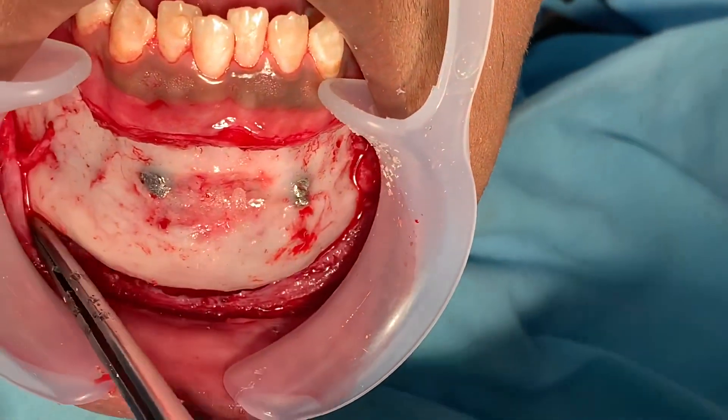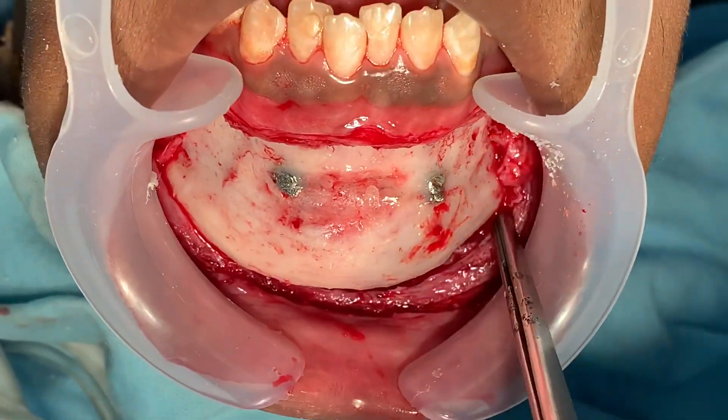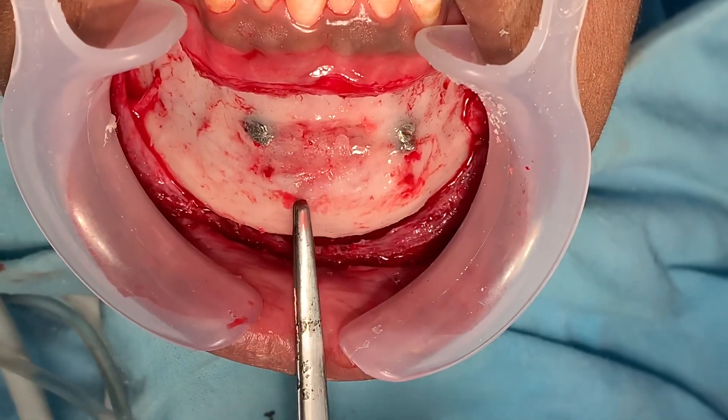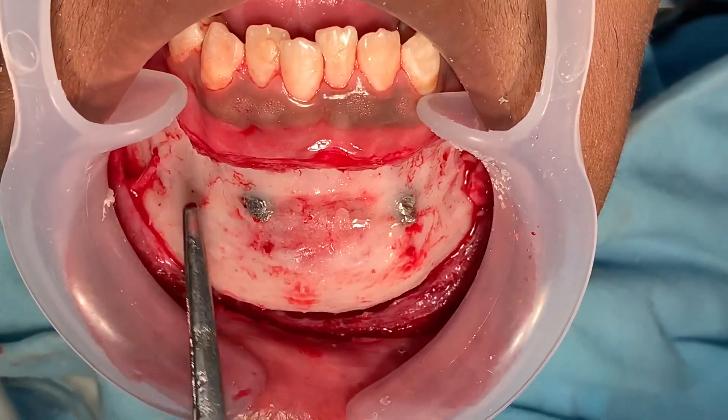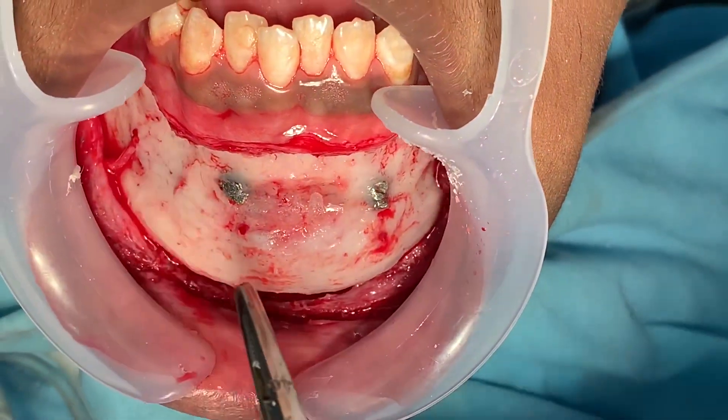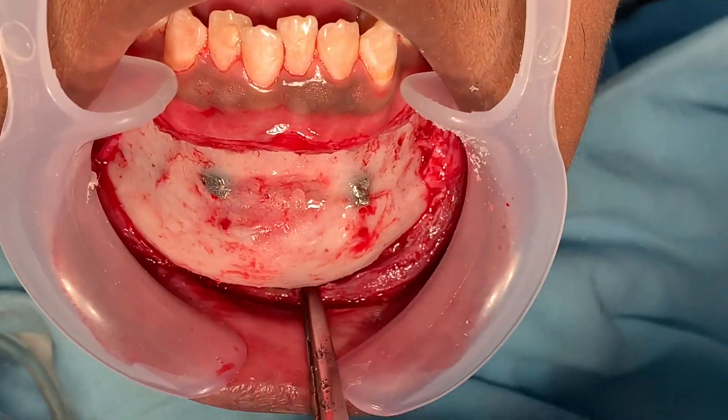I've also done a vertical reduction of the genioplasty. We've taken down a few millimeters of the chin, made it a little bit broad, and given it a little bit of a point there. Basically, the entire chin has been sculpted to fit the patient's face.